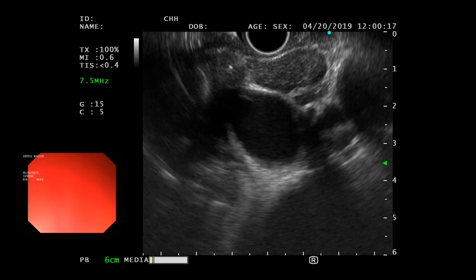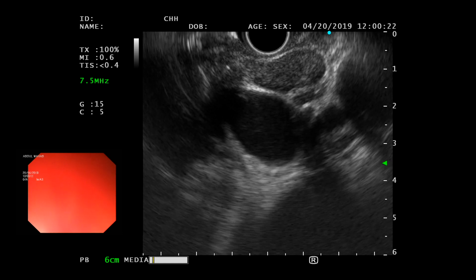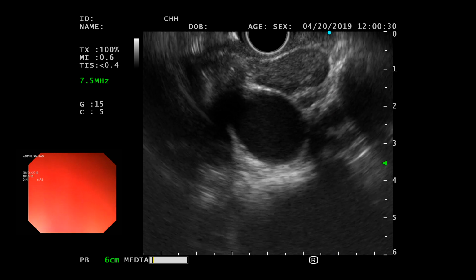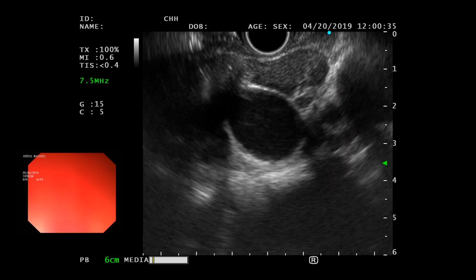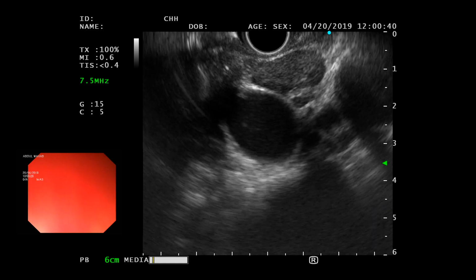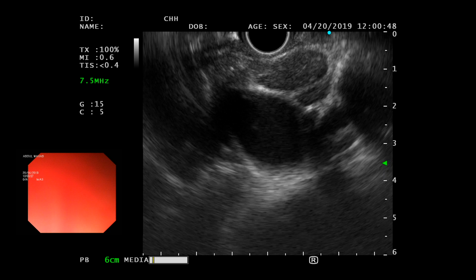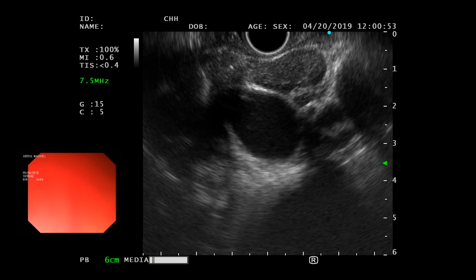आगे था सैंपल कुछ? सैंपल सर उसमें आया, अभी स्लाइड बना रहा है, लेकिन और रिक्वायर्ड? नहीं, ब्लड तो ठीक है अपनी जगह, लेकिन कुछ उसके अंदर बीच में टिश्यू भी होगा. है सर उसमें, अभी वो स्लाइड बना के आपको दिखा दूँ. अब एक कोर आया है, नहीं आया यार? और आया है, ये भी छोटा है. क्लॉट कह रहा है, अगर वसीम क्लॉट कह रहा है तो that will be disappointing. मेरे हाथ से पूरा लगा. मैं सर गॉज़ तो रख देता हूँ. बहुत सारे रखे हुए हैं. It was right there in the note. क्या चीज़? नो, आई एम प्रीटी श्योर उसमें सैंपल होगा. ऐसा नहीं, आई डाउट इट.